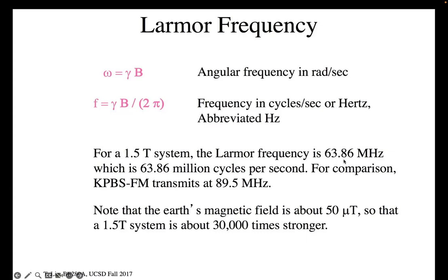this frequency here. So one of the things you need to do when you're siting an MRI scanner is you need to put it in a Faraday cage or an RF shielded box. So the whole room has walls that have either copper behind them that are all sealed up with really good welds. And if there's glass, the glass has to have some kind of permeated conductor in it so that RF can't get in or out. If you don't do that, when you make your picture, you're going to get all this RF noise from the environment. And so it adds to the expense of siting an MR scanner and the time.